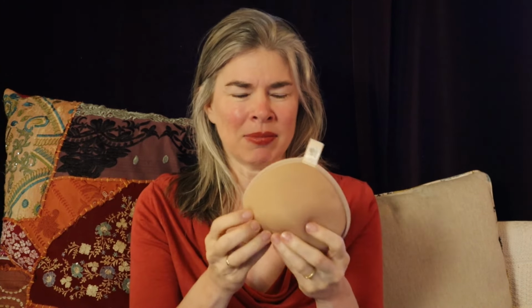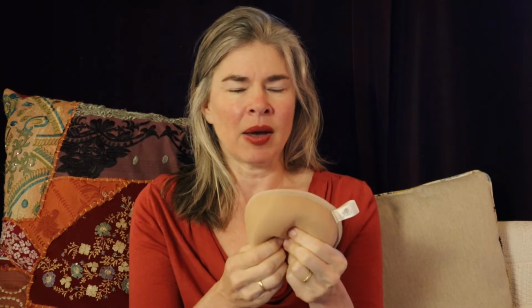You can get a silicone breast prosthetic for swimming also, and that is a solid prosthetic. It's made of solid silicone, but it has channels carved into the back of it to allow water to flow through the back of it, only in one direction, up to down, assuming you're swimming forward when you're wearing it. And that did not appeal to me, both because it's very heavy and just that the channel didn't make sense to me. This made much more sense. I felt like this would be a better match for me, and allowing the water to flow through and it being really lightweight seemed like something I'd be willing to wear, maybe.